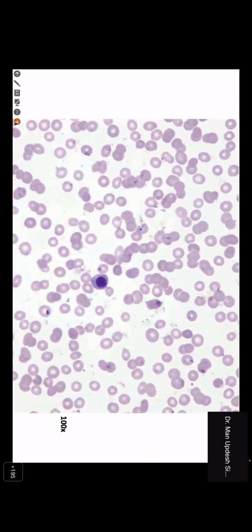And what cell is this? Target cell, sir. I'm pointing to the cell. It has a nucleus. Nucleated RBC. Yes, nucleated RBC. So you see that there are circulating nucleated RBCs and circulating myelocytes in the peripheral blood, which has a very low count.